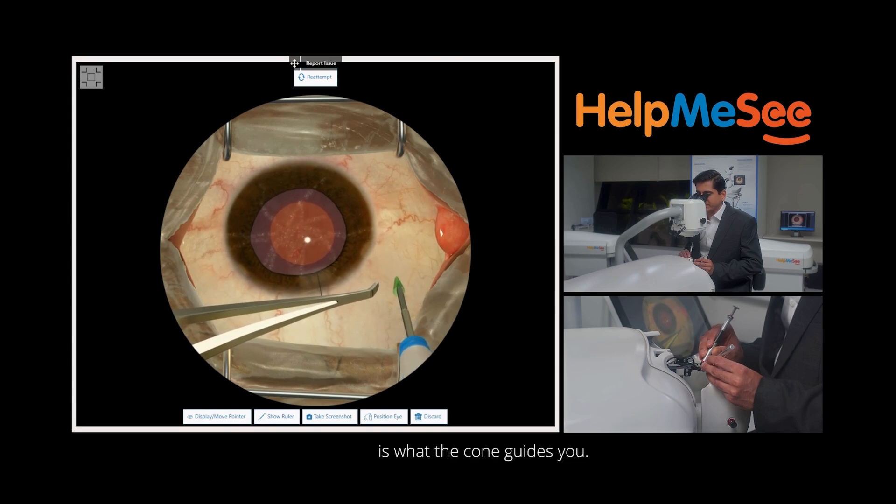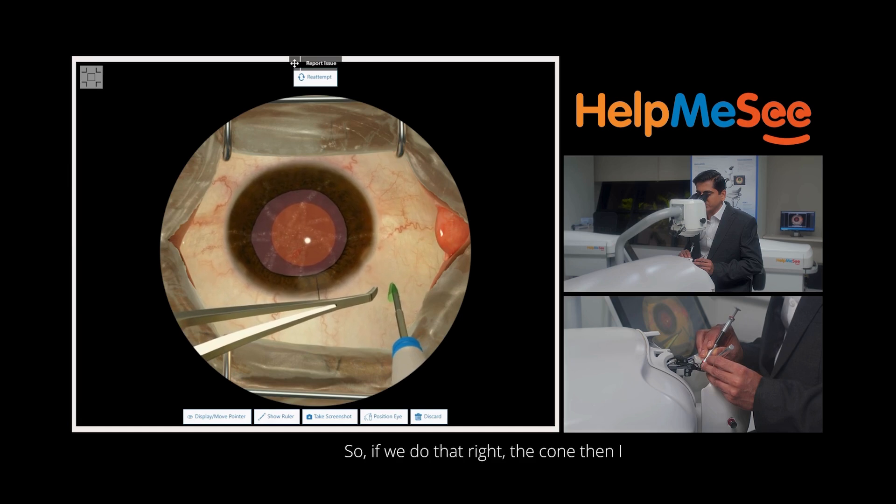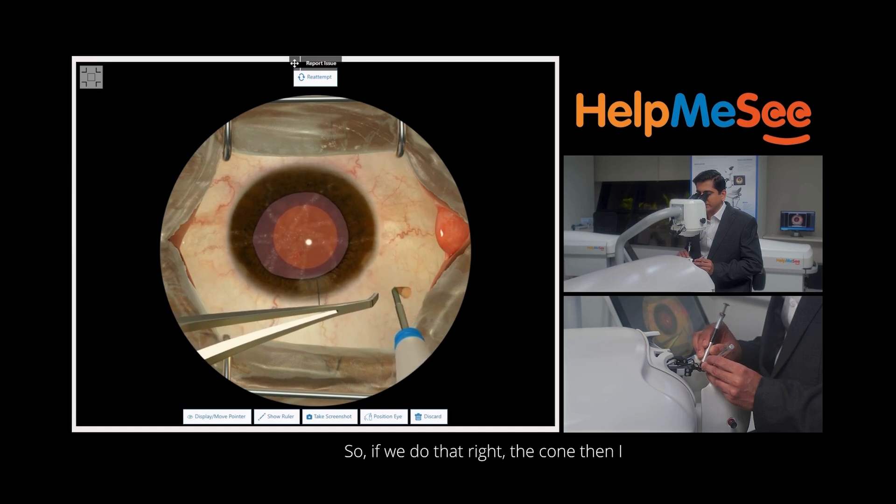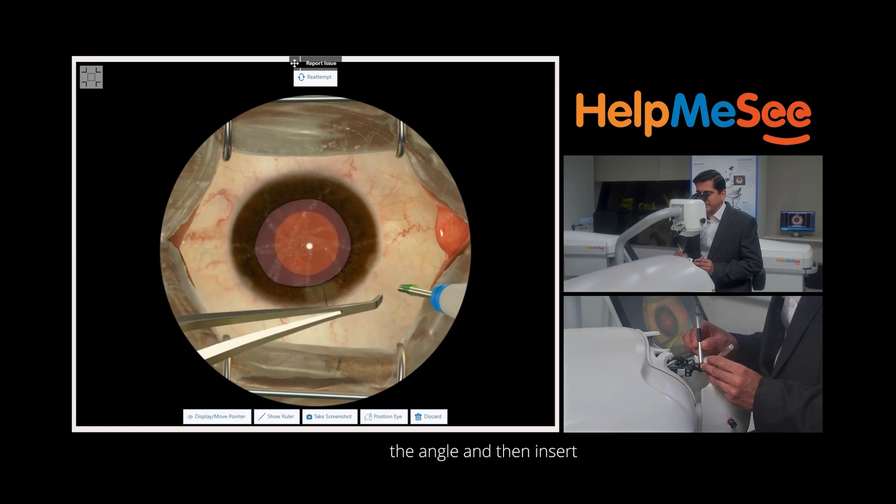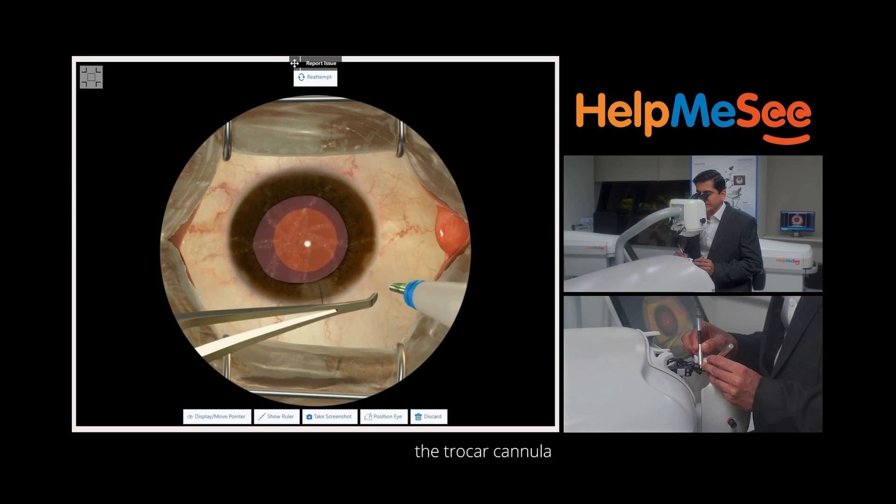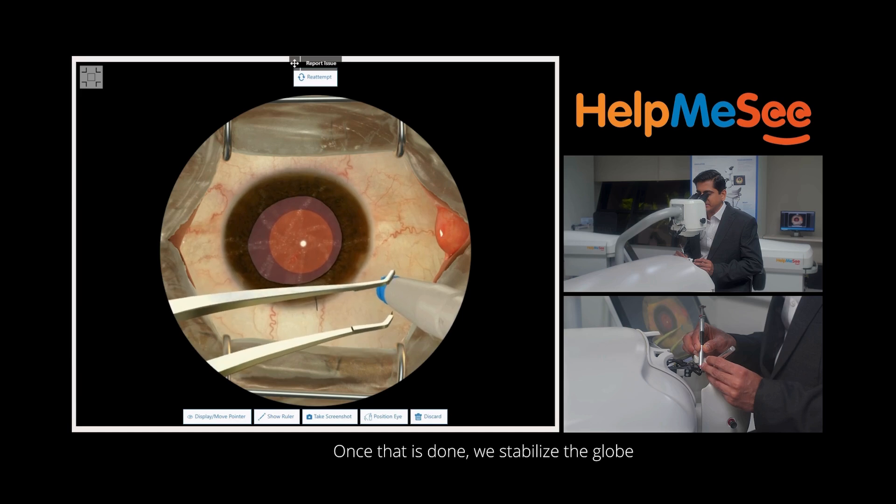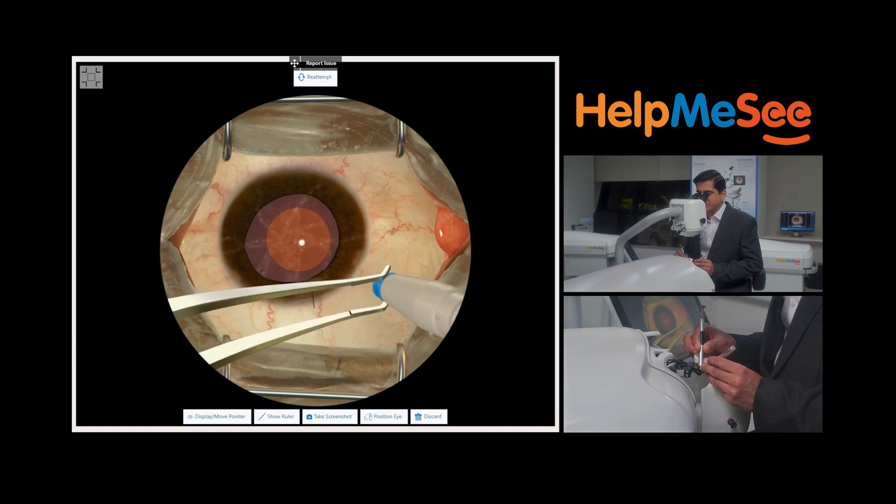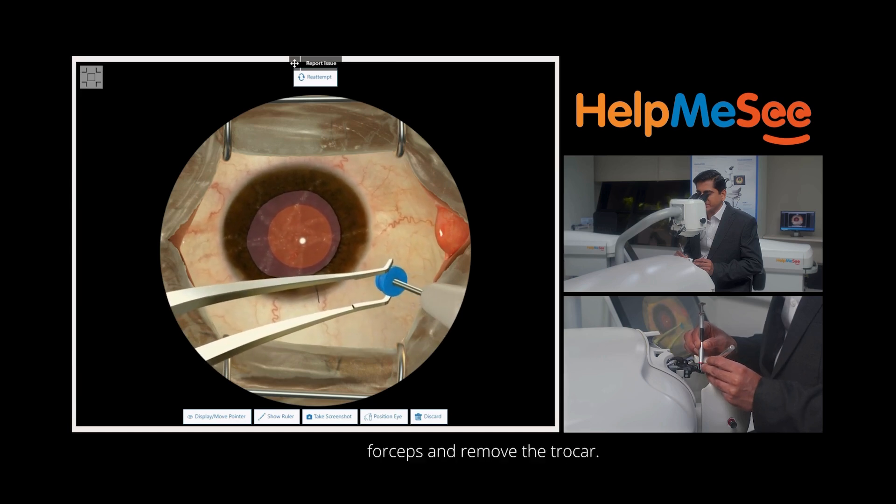The first angle of entry is what the cone guides you. If you do that right, the cone then asks us to change the angle and then insert the trocar cannula system inside the globe. Once that is done, we stabilize the globe with the colibri forceps and remove the trocar.